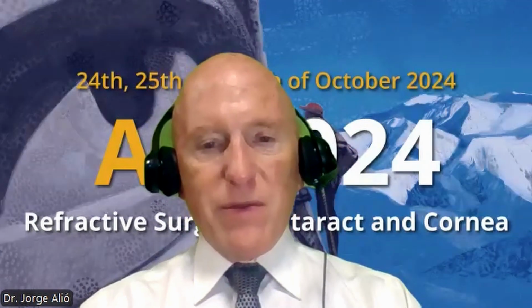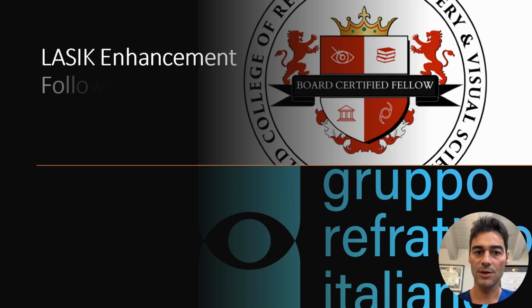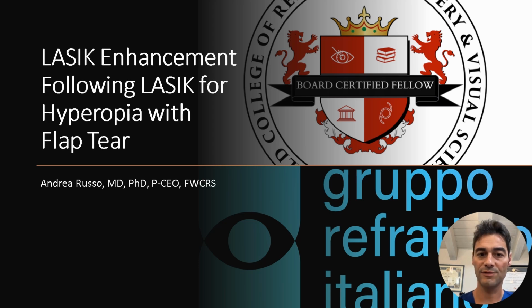Thank you, Professor Jorge Alio, for inviting me to this session, where I will present this case about LASIK enhancement following a previous LASIK for hyperopia with a flap tear during the first LASIK.